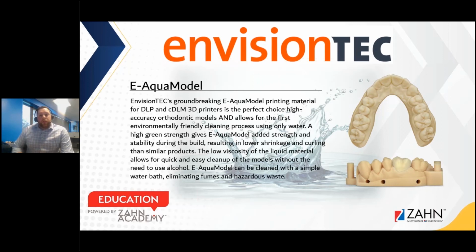There are no toxic fumes that you have to deal with, and it's going to be a lot cheaper to run. What's also great is that, coupled with this new process, they maintain the structural integrity of these prints. So you're not losing any accuracy or hardness within the model itself. Actually, if anything, I think it makes it a little bit harder, I think the specs say, so it continues to have that added strength we've seen throughout, and allows us to have the benefits of the E-AquaModel, or the Aqua process.